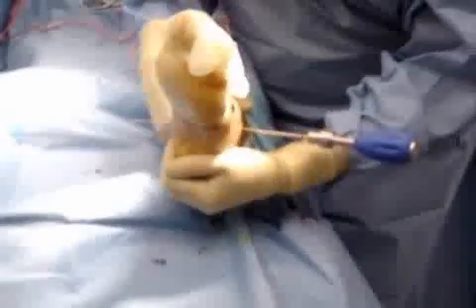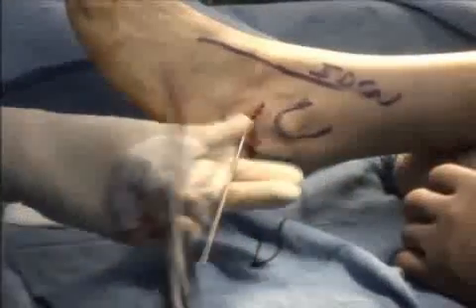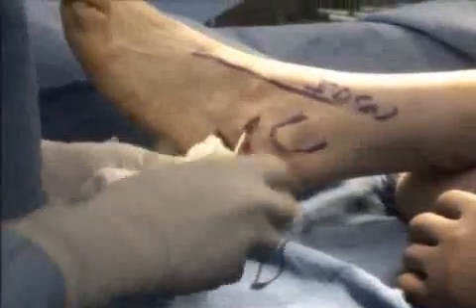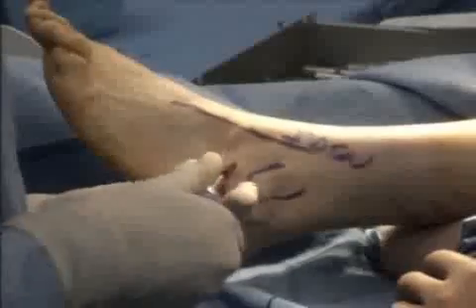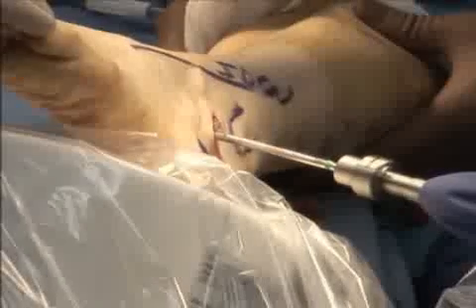If you feel like you have a good reduction of the eversion, you can certainly just stop. What I like to do is look at where the skin lines line up with the laser markings on the sizers — generally these markings line up with the skin between 2 and 3 centimeters, which gives you a good idea for depth. Then again, assess the subtalar eversion, and if you have too much eversion, go up with the size until you get a sufficient reduction.